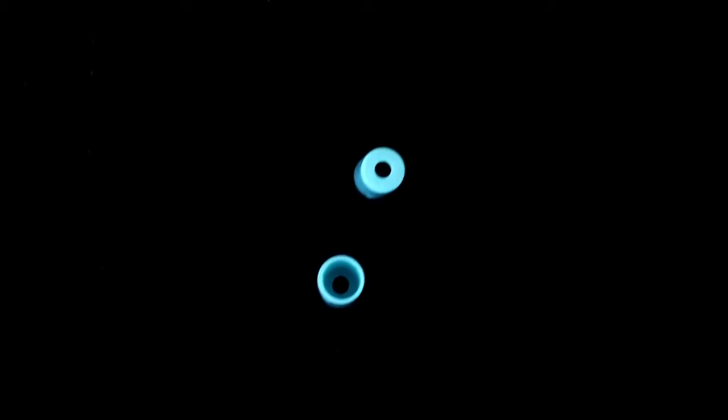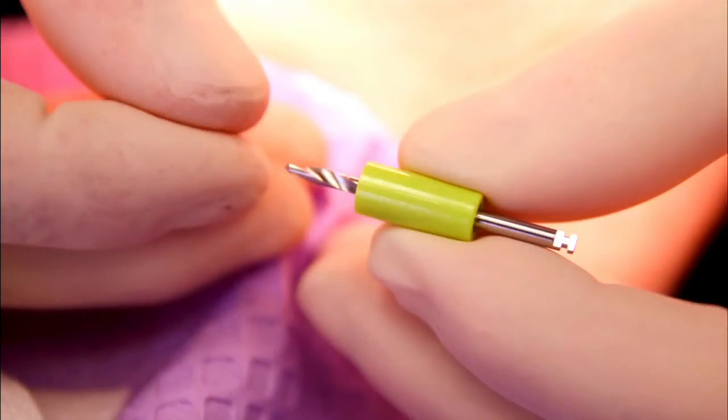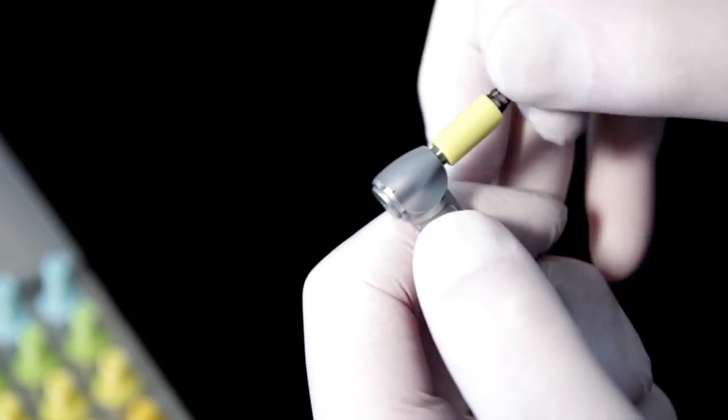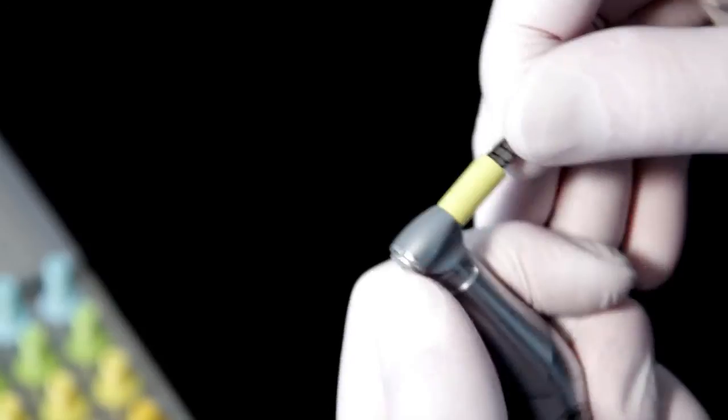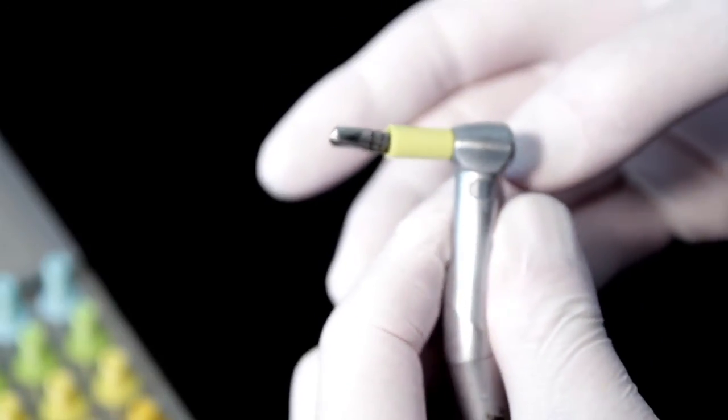There exist two models of drill stops. The original model slides over the drill, and when latched to the handpiece, is locked in place. It fits snugly, will not come off, will not generate heat, and will not damage the handpiece.